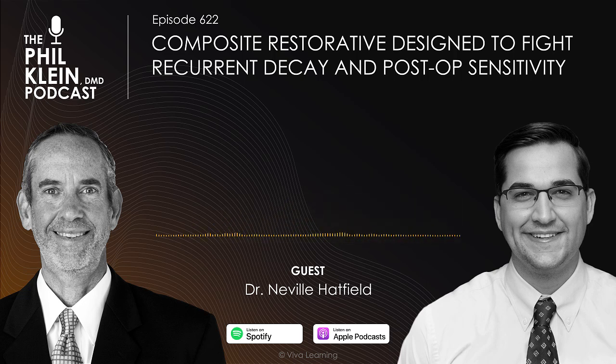But one of my biggest things, and I think what I look for mostly, is finding materials or finding companies that really put the effort into the research and development to find how they can best help the consumer, which is the dentist, and then ultimately the benefactor of the consumer, which is our patients, right? So a big component of research and development is now going into bioactivity. Bioactivity is basically taking this concept that in the past, our materials were very passive in the oral environment, but we're in an inherently dynamic environment with temperature and chewing and pH changes from bacteria. So there's nothing that is passive about our mouth.